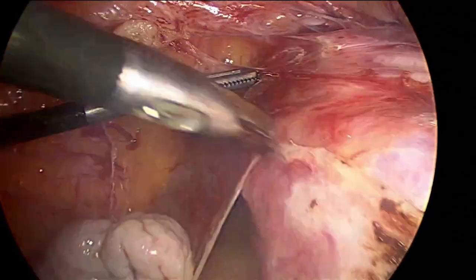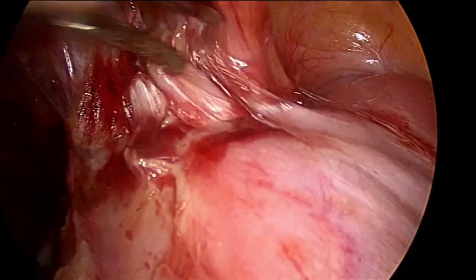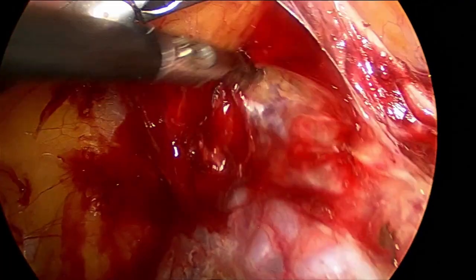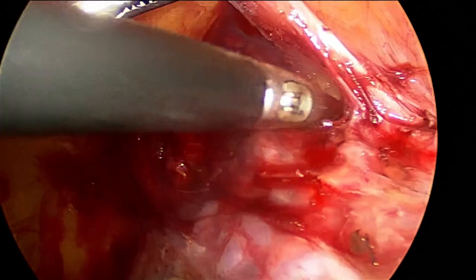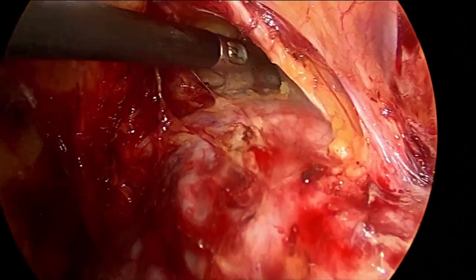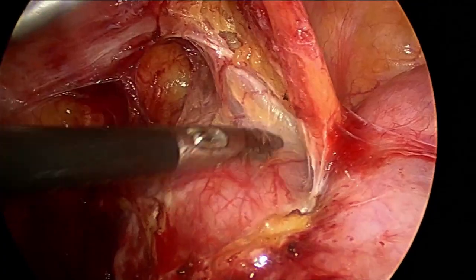The uterine vessels were identified for the bladder dissection. We used a retrograde manner of dissection here. First, we made a blunt dissection above the uterine vessels to dissect the bladder deep down, and this dissection was carried out further; the dense adhesion band at the scar site was released last. These steps were repeated: first dissecting the bladder below, then releasing the adhesion band off from the uterus, remaining near the uterine surface. The whole bladder should be lifted up to release these adhesions, and good adhesiolysis should be carried out deep down.